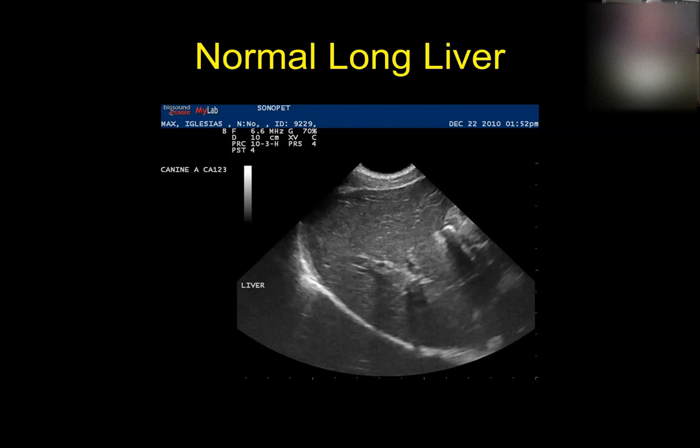In the human literature, the head or cranial is to the right. And so the veterinary cardiologists got in the habit of imaging it backwards. So heads to the right when you're doing echoes. Any other imaging modality in veterinary medicine, heads to the left. Okay, so that's why it's the opposite with echoes. They had to complicate things.